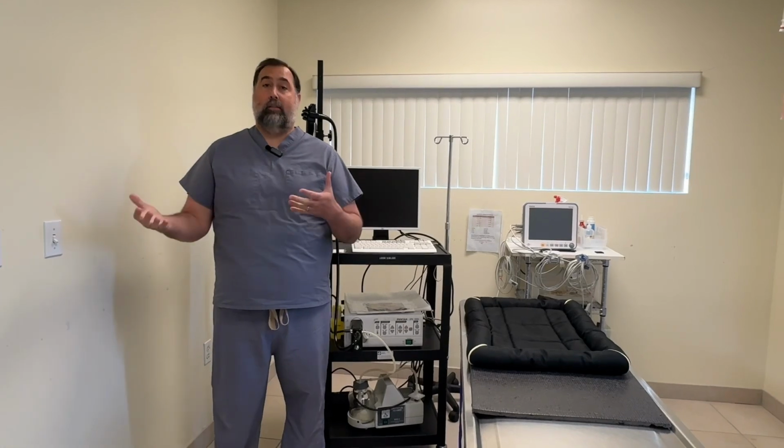Why are endoscopies important? Great question. I think that it adds to our toolbox. Everything we do diagnostically has pros and cons. X-rays are wonderful, we take a lot of X-rays, but sometimes we can't see everything we need to. So I think endoscopy gives us another avenue to visualize the intestinal tract or parts of the intestinal tract that we don't have with other modalities. Again, X-ray and ultrasounds are great. We use them a lot, but they aren't perfect. And it also allows us to get biopsies of those parts of the intestine that we would otherwise have to do surgically, which is again fine, but a lot more invasive. So it does allow us to diagnose and to see things that we can't otherwise, and to do things in a little bit of a safer manner.